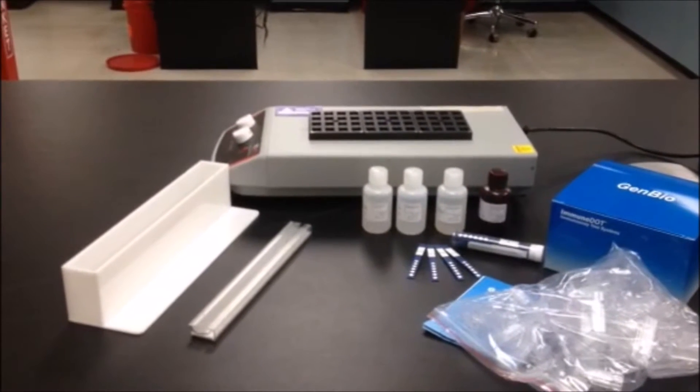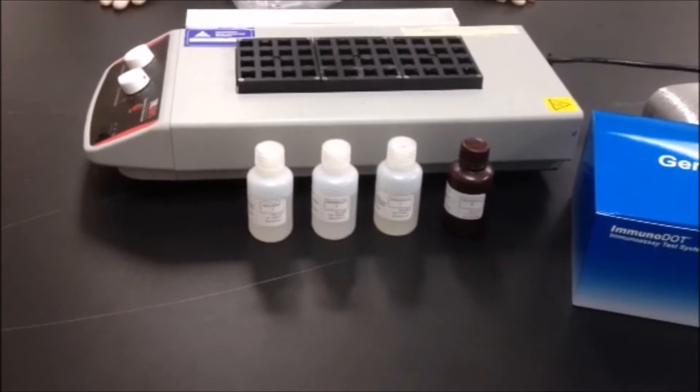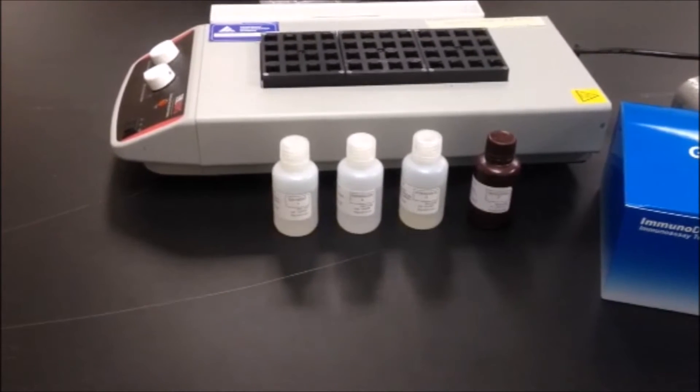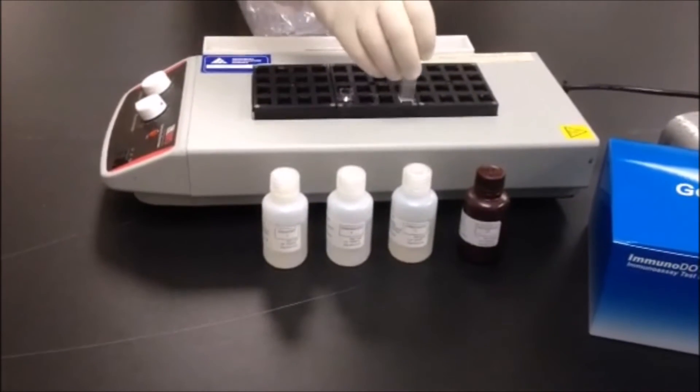Before starting an immunodot assay, turn on the workstation. From the kit, remove the reaction vessels provided and load them into the block on the workstation. You'll need four reaction vessels for each patient to be tested.